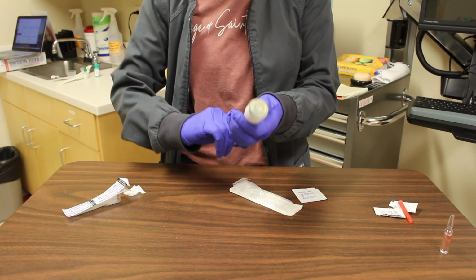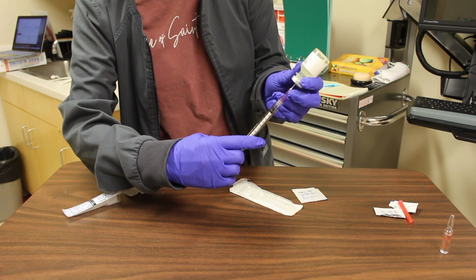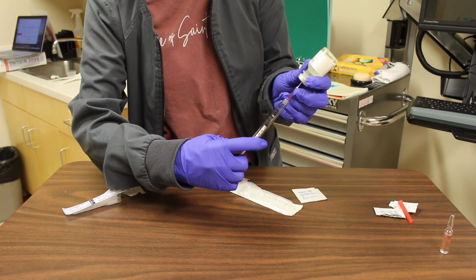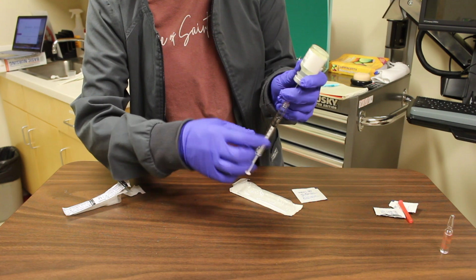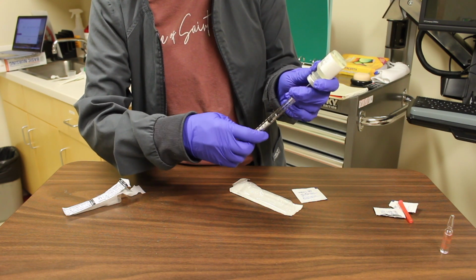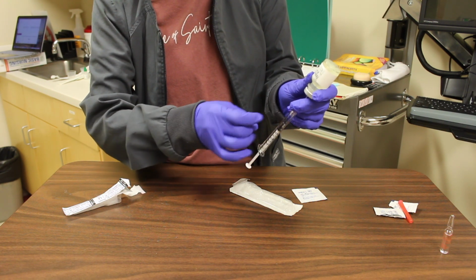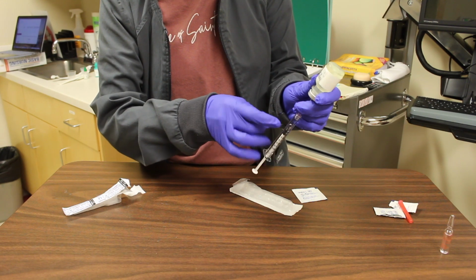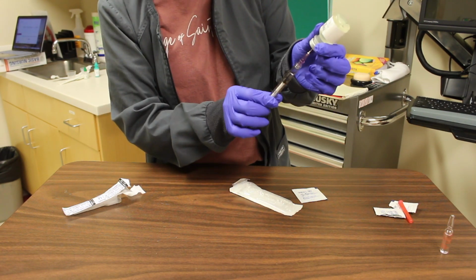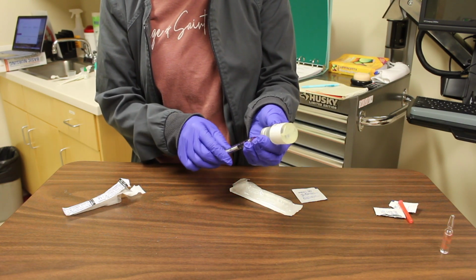Invert the vial, keeping the needle vertical to the medication. Slowly draw the medication to the ordered amount. Keeping the needle in the vial, remove any air from the syringe by injecting the air back into the vial. If there are air bubbles, carefully tap the syringe, pushing the air towards the top. Once the air is at the top of the syringe, push remaining air into the vial and ensure that the medication that is in the syringe is still the same amount that is ordered. If not, draw more medication back.